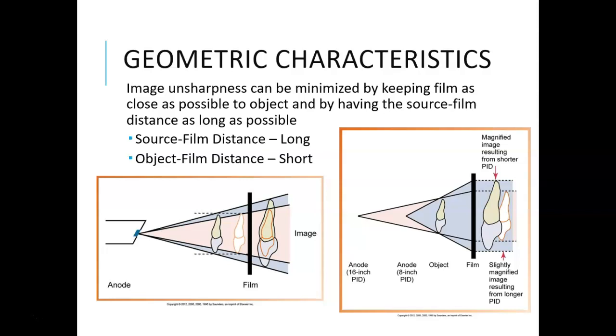We want to keep the film close. And in the paralleling technique, you can see that we sometimes have to put the film back a little bit in order to get it parallel with the tooth. So it's all a balance. There are many factors involved to help us get a good picture.